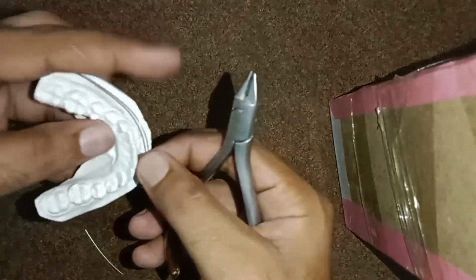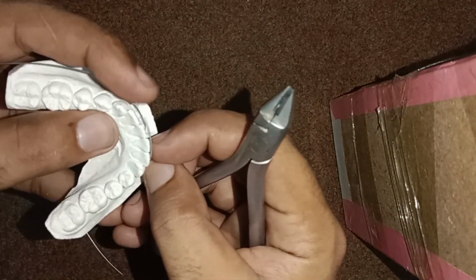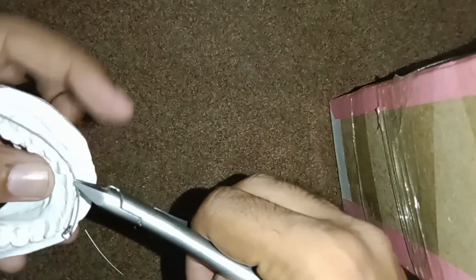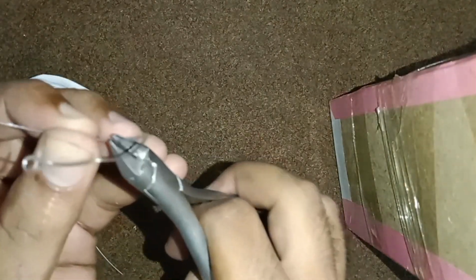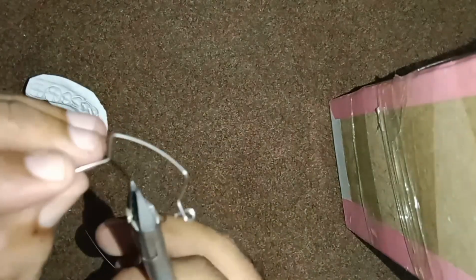Similarly, on the left side, we will place a mark distal to the lateral incisor, hold the wire from that mark, and give it a 90-degree bend downward. Then again at 6 to 8 mm, we will give it a distal bend of 90 degrees.